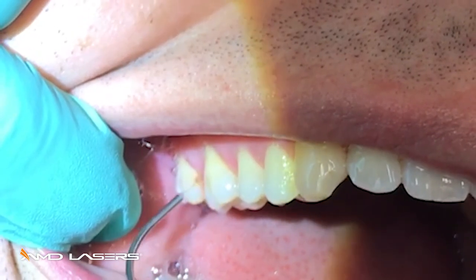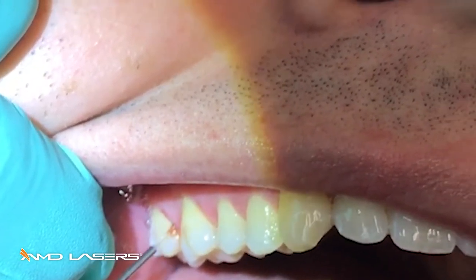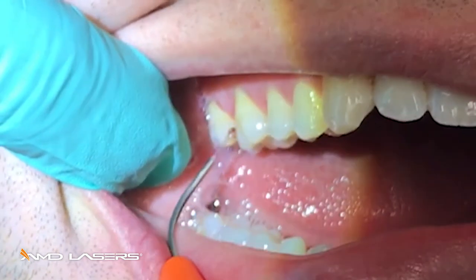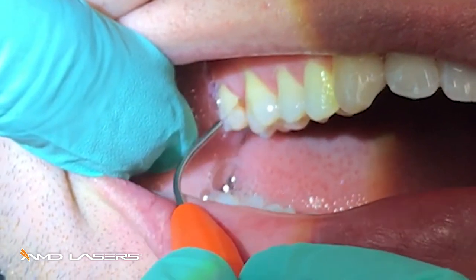Do both sides of the papilla, gently sweeping against the tissue. All that necrotic tissue — gone. And the patient is feeling very comfortable.